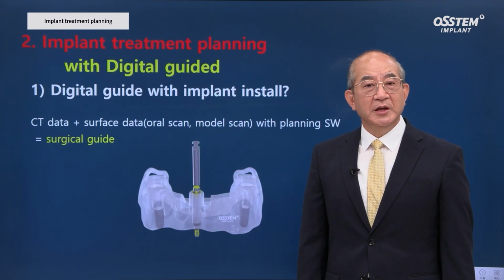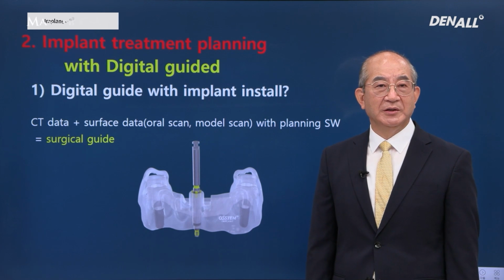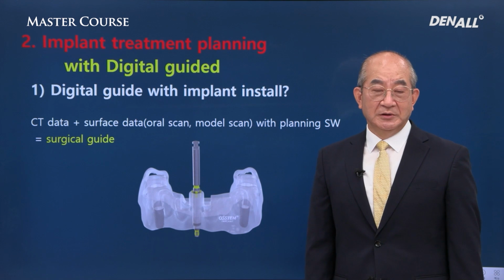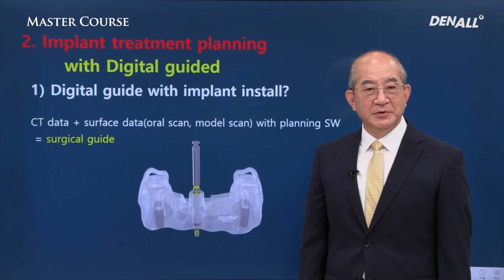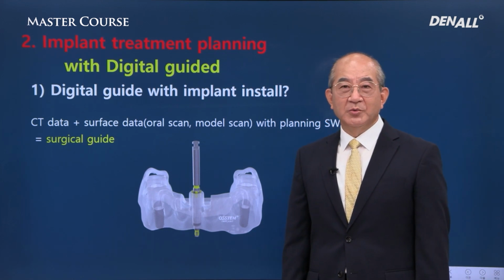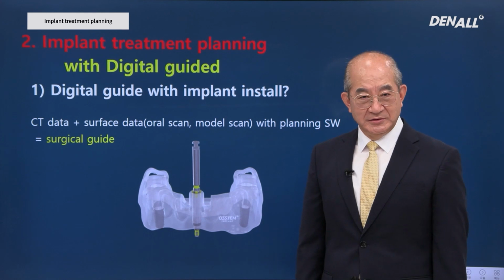Next, I'm going to talk about digital guided implant surgery, which has become more widespread these days. Those of you watching this program, how many of you know about X-ray film, which used to be used at dental clinics? What I'm trying to say is that in the past, standard X-ray and panoramic images were frequently used in dental clinics in the old days.